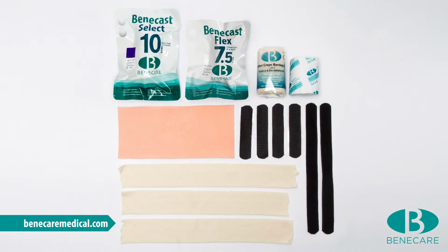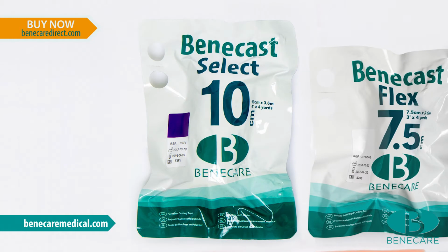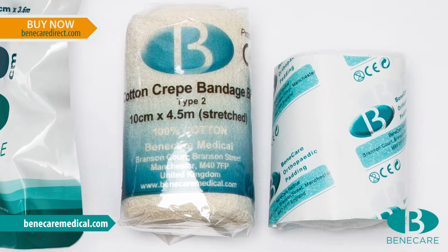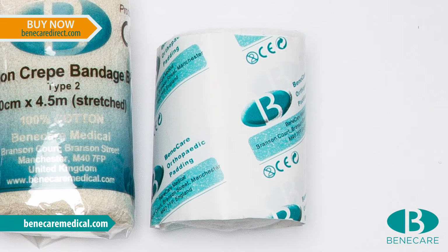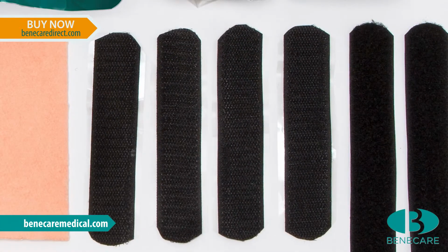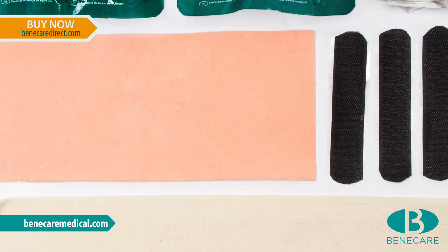The materials required for a DFU slipper are 1 roll of 7.5cm Benecast Flex, 1 roll of 10cm Benecast polyester, 1 roll of Benecast Crepe bandage, 1 roll of Benecast padding, 3 pieces of Benecast stockinette, 4 pieces of Benecast hook, 2 pieces of Benecast loop, and 1 piece of fleecy web.